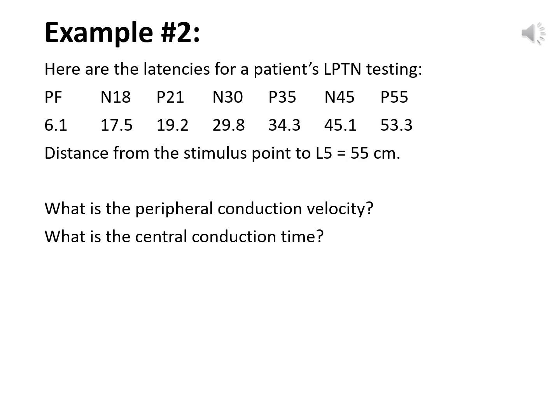And so here for question number 2, we are given latencies for a patient's left posterior tibial nerve testing.